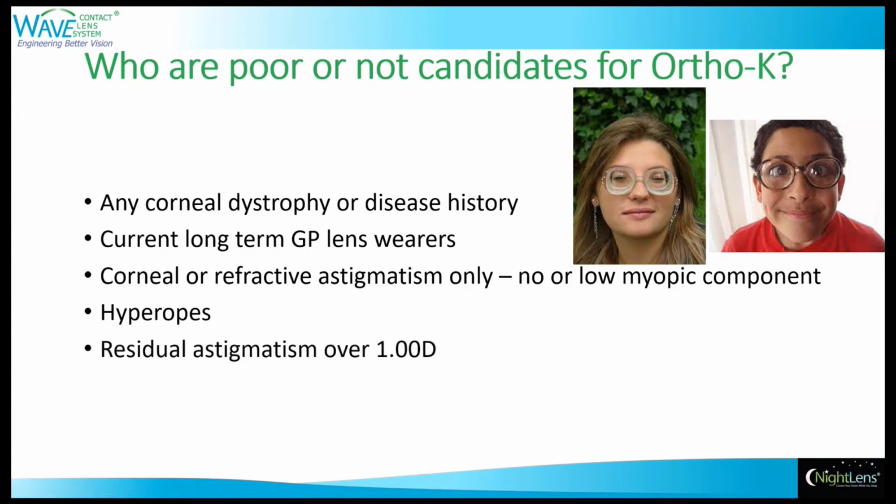All right, other refractions that include residual astigmatism over a diopter.